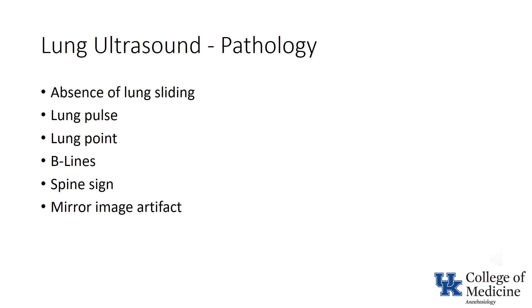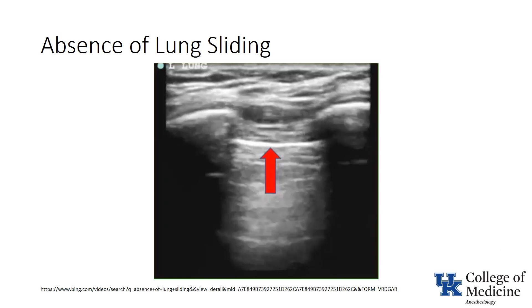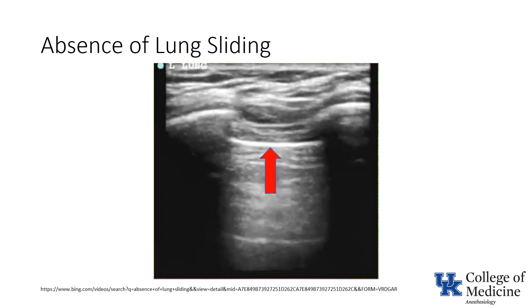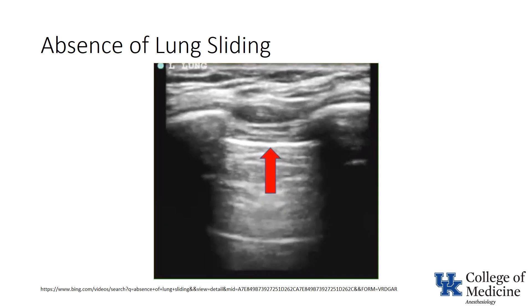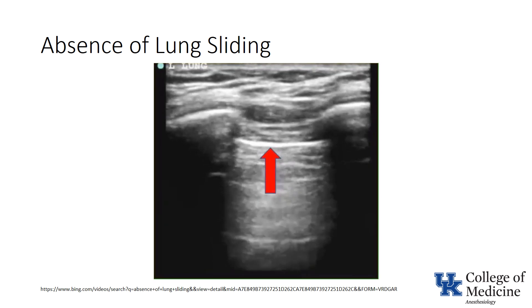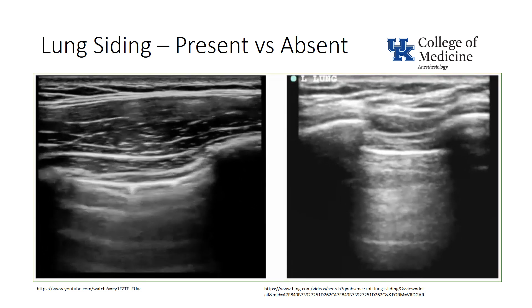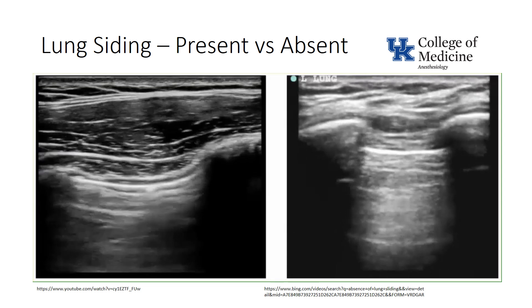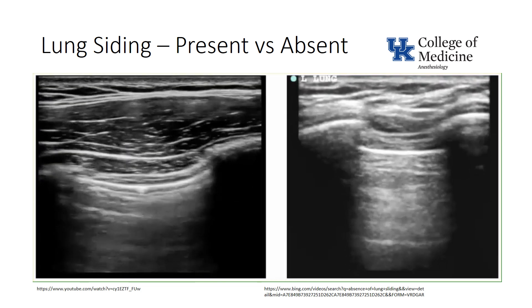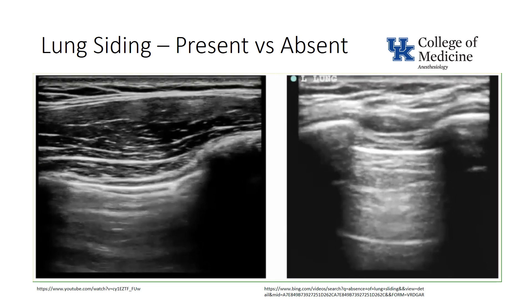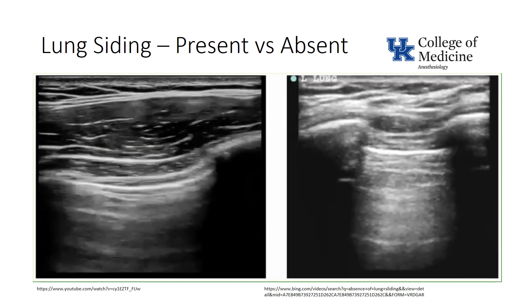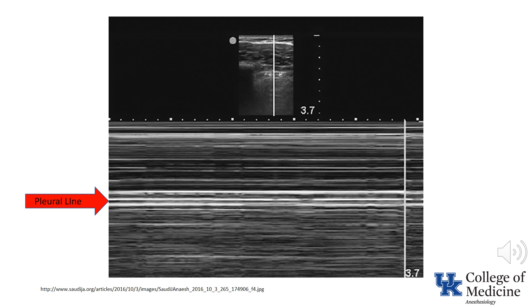Watch this video. Notice that although the pleural line moves, there is no shimmering or sliding evident, indicating the absence of lung sliding. Notice the difference between the motion of the pleural lines on the two videos: the video on the left clearly shows back and forth movement on the pleural line, which is absent from the video on the right. This M-mode image, termed the barcode or stratosphere sign, shows parallel lines below the pleural line essentially indistinguishable from the area above it.